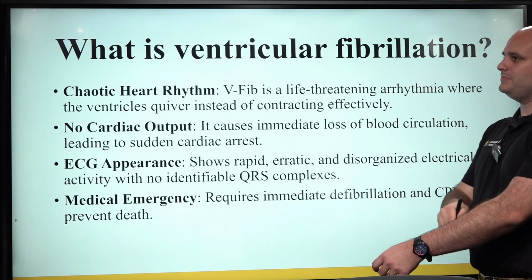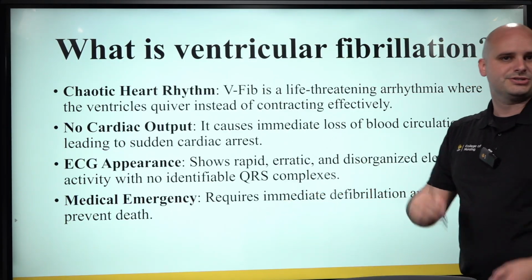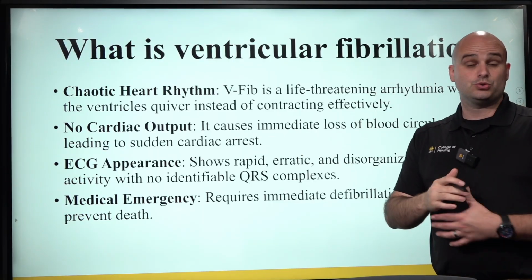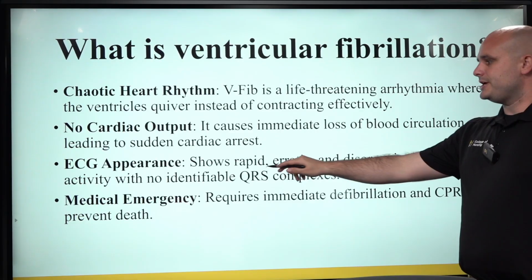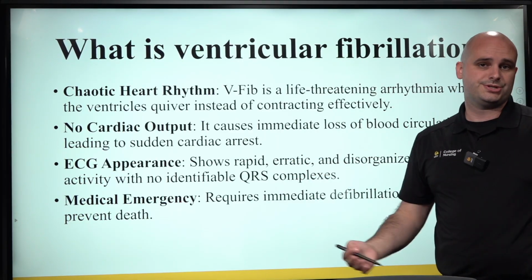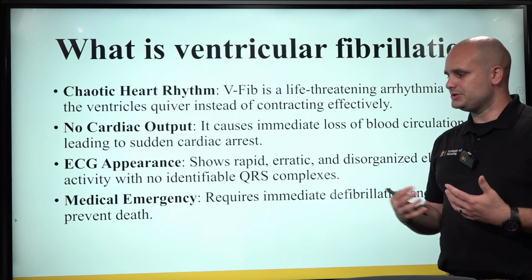So what is VFib? VFib is a chaotic heart rhythm. It looks like just a squiggly line. No cardiac output, so these patients will never have a pulse that are in VFib. The ECG shows a rapid, erratic, and disorganized rhythm. And this is a medical emergency. These patients are in full cardiac arrest. They have no pulse, and they're relying on us to resuscitate them.